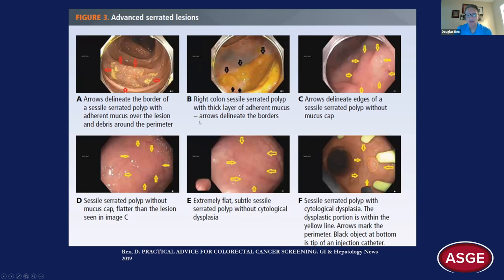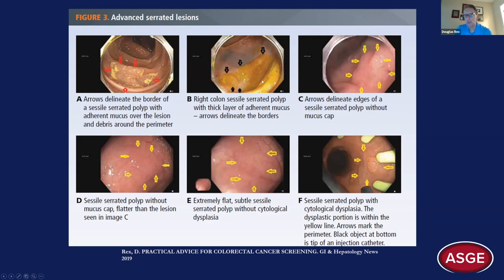This slide shows pictures of serrated lesions of progressively more subtle nature as you go across. The bottom middle is a lesion that looks completely flat, and the bottom right is an SSL. The best term now is sessile serrated lesions — sessile serrated adenoma, sessile serrated polyp — all those terms are virtually synonymous. SSLs can either lack cytological dysplasia, or have it, appearing as a little area that looks like a conventional adenoma. Experts are concerned that sometimes people see the dysplastic portion but not the entire perimeter.